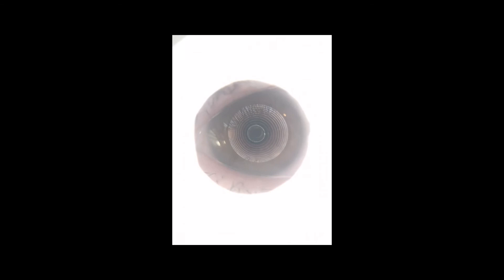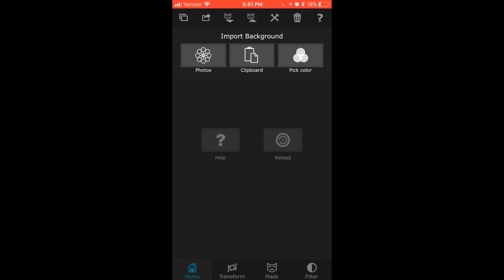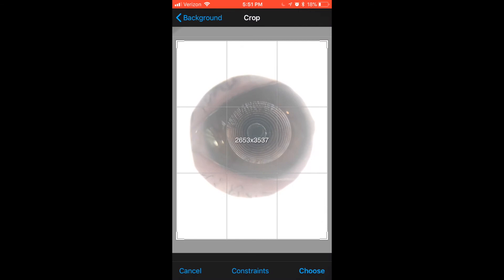From there, we're going to go back into the Superimpose app, and go to Import, and then go to the two boxes, and you're going to get the sign that says Import Background. We're going to press Photos, and then this should be the first image that I just captured here. I'm going to crop it so you get much closer to the cornea, and I'm going to press Choose.